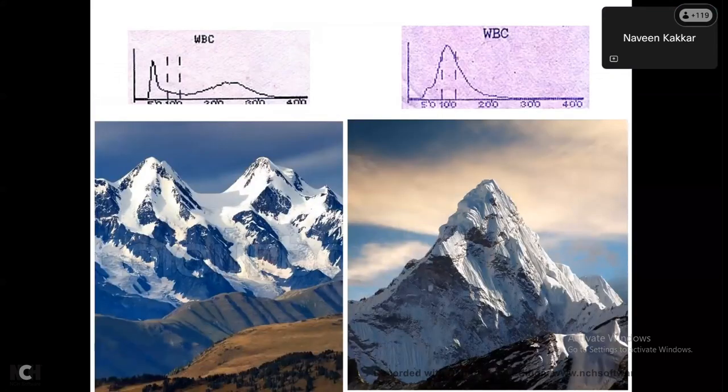So remember this: two peaks in its own zone means normal population, and you could have variation in counts, yes. But this kind of a picture means abnormal population. This could be blasts, atypical lymphoid cells, NHL spillover. Even viral lymphocytes can confuse you sometimes. So you need to basically see the smear to sort it out.